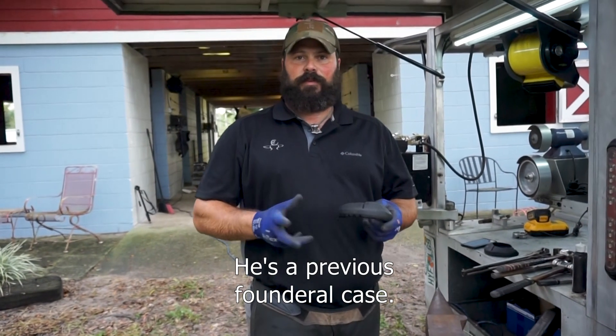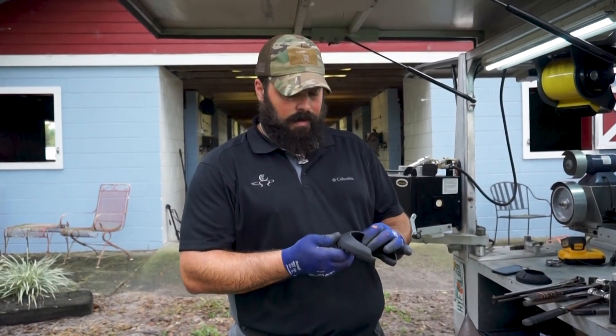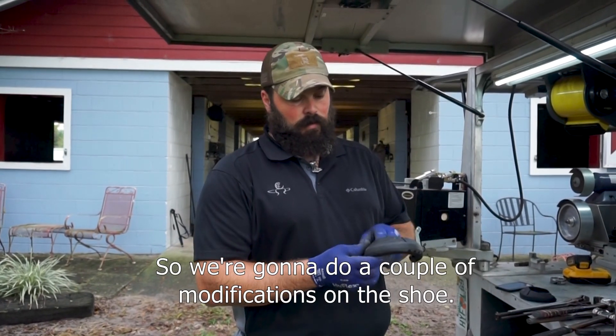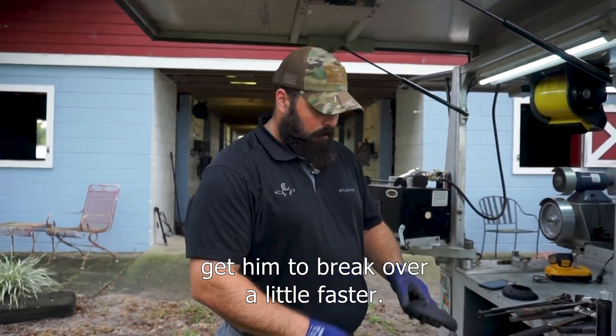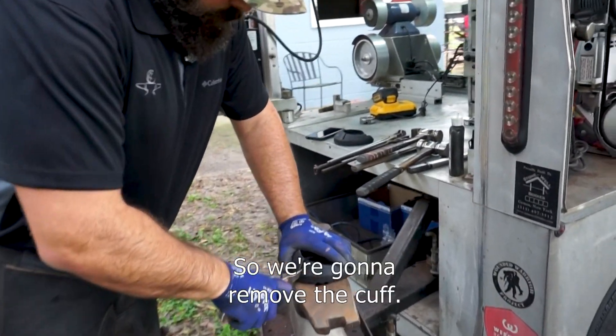Slim is a previous founder case, so he's chronically foundered. What we need to do is improve the breakover, so we're going to do a couple of modifications on the shoe to get him to break over a little faster and take the stress off of the deep flexor.